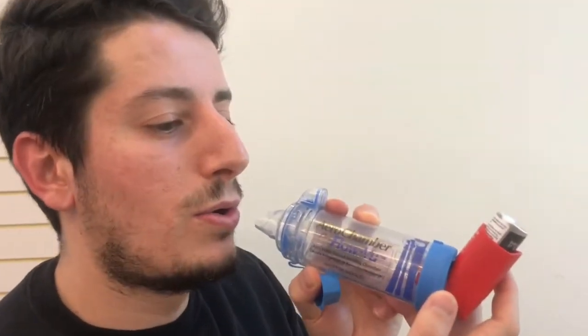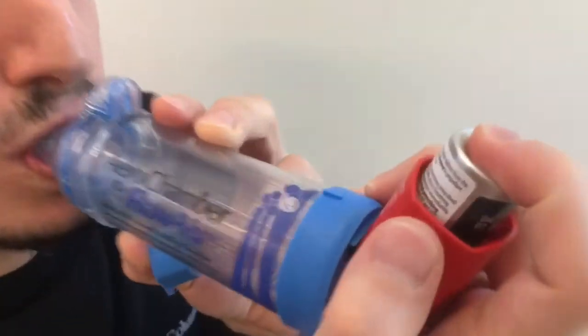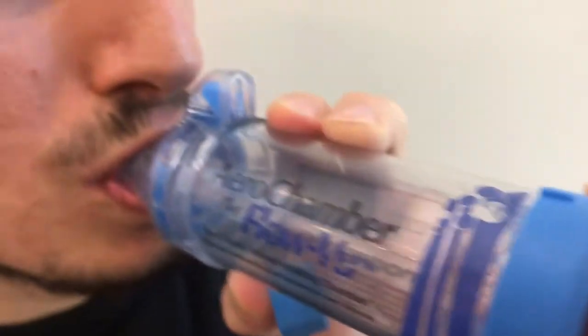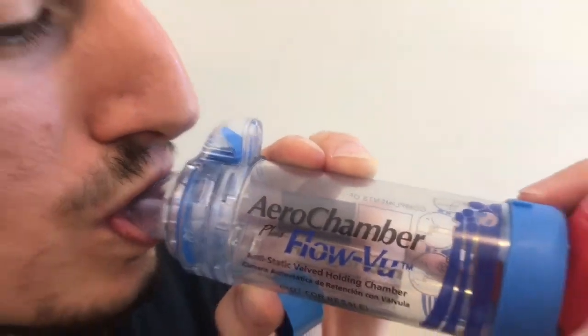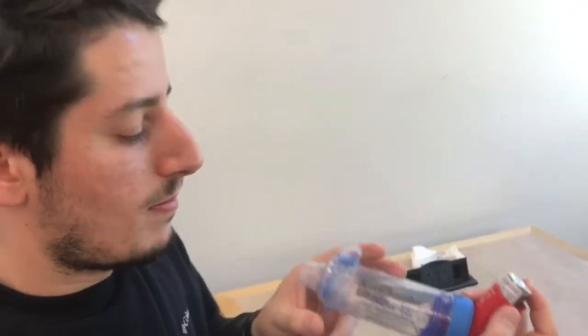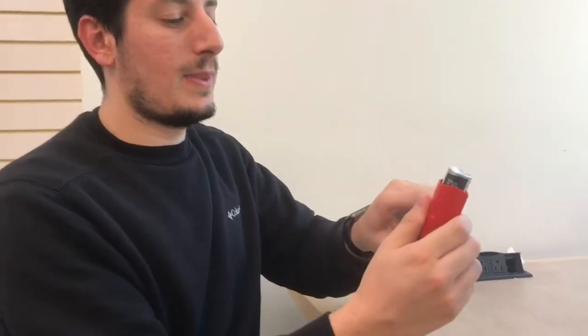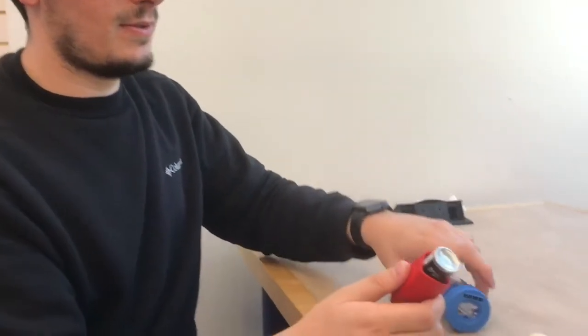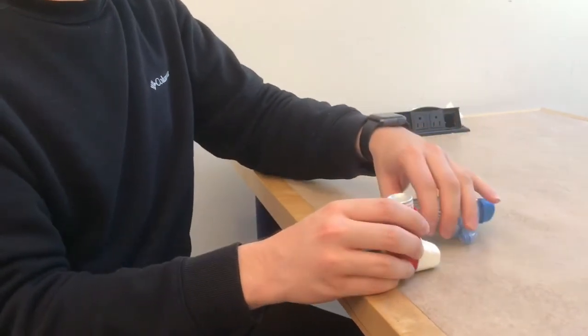Again, exhale fully, and then you're going to go ahead and do a full seal over this chamber right there, and then inhale, and that little flap at the very top allows you to see how much you're inhaling. So 1, 2, 3, and then exhale very slowly again, and that's how you use the chamber with your inhaler.